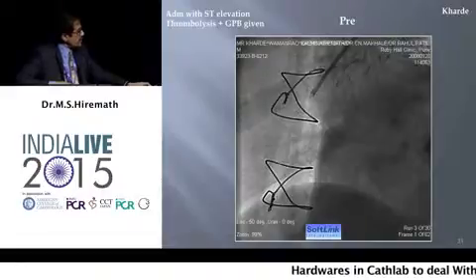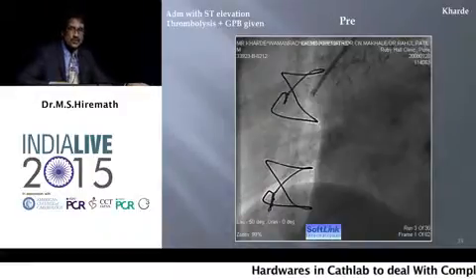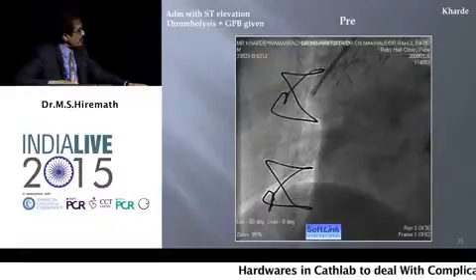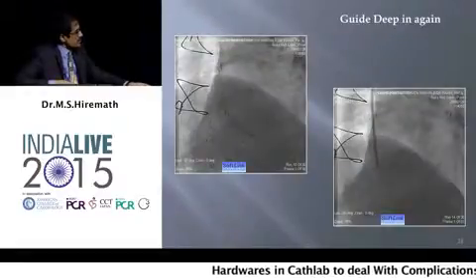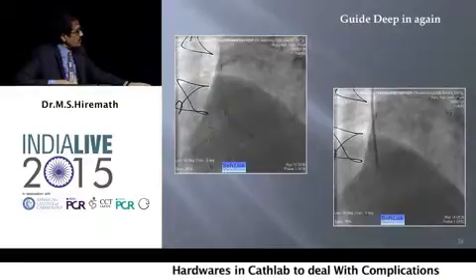What about the vein graft? Can you run it again? You can see that there is hardly any flow, but we persisted because this was a recent total occlusion based on the history. And what we have done here is got the 7 French guide catheter all the way to the distality. Can you run that?